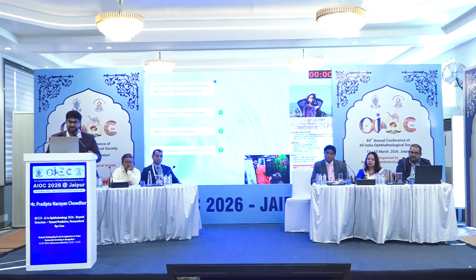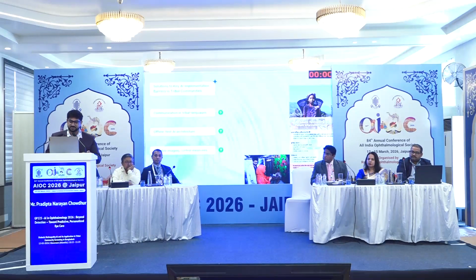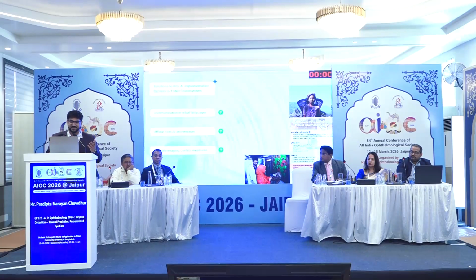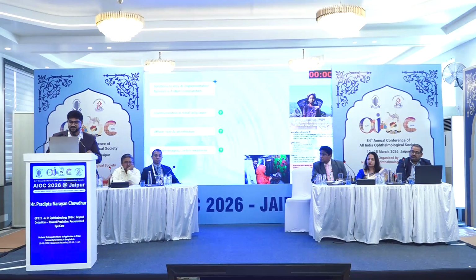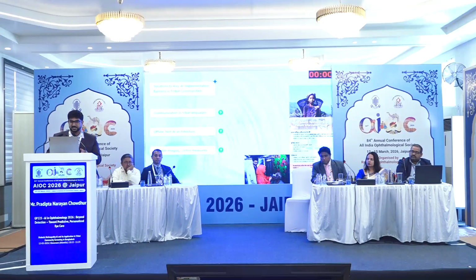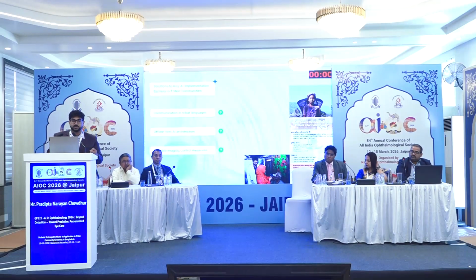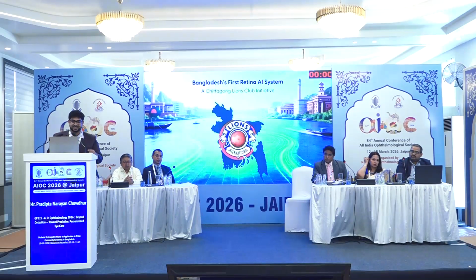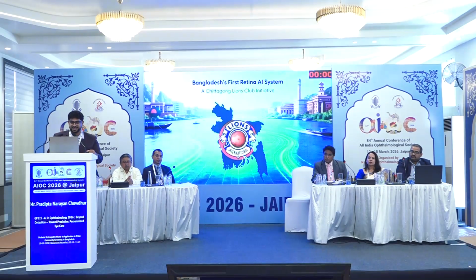For now, because this is a very new concept, we did it in the hut of one of the houses of the people. They're very gracious, as you can see in this image. But moving forward, we plan to implement portable tents, and we want stricter portable imaging control measures. So that's it. That's how we built Bangladesh's first retinal AI system.